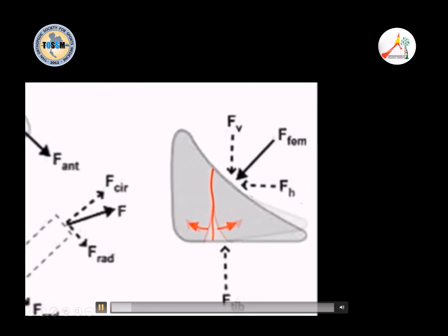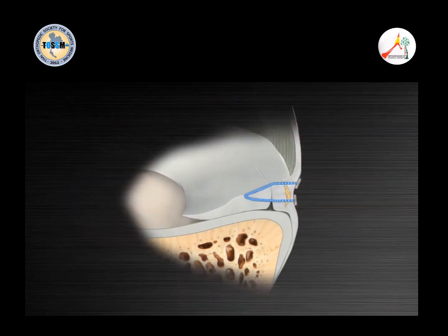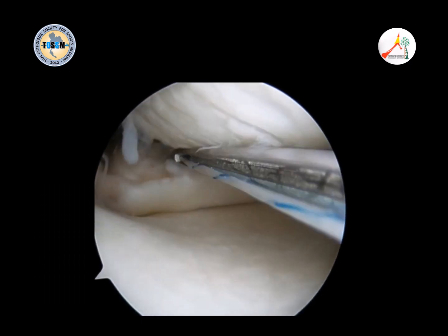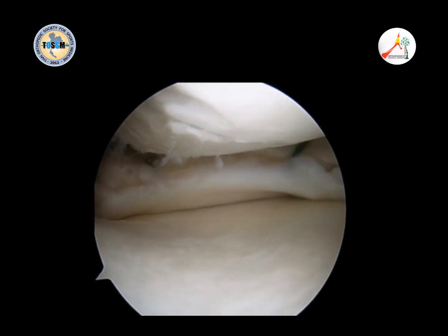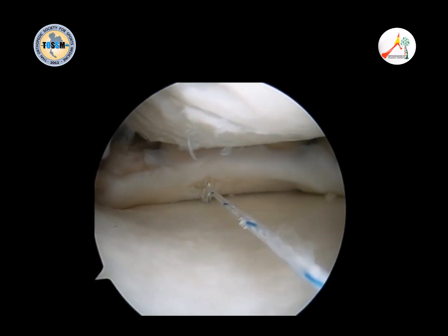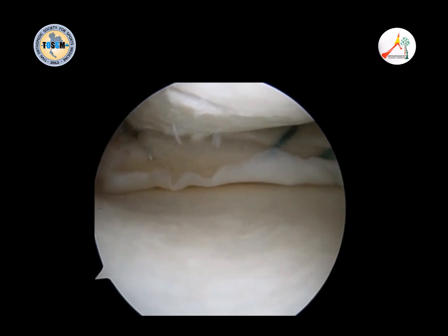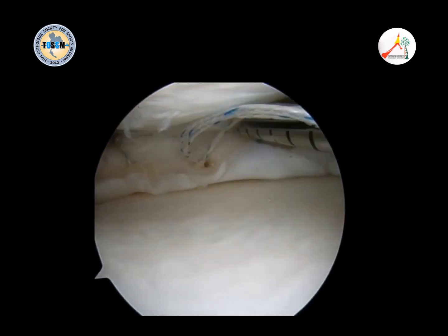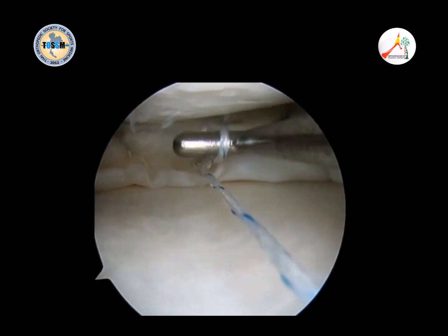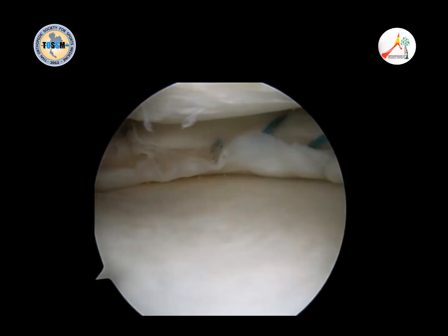And how to improve? You know that if you repair only one side, when the patient puts weight on, the meniscus will split on the under surface. Because sometimes you have very limited space because the joint is so tight. If you repair like a mattress, that's not enough. You will need to repair upper and lower. You see? You repair upper, the meniscus will invert. And you repair lower, the meniscus will reduce again. So do it this way, upper and lower, to protect the meniscus from splitting on the under surface.